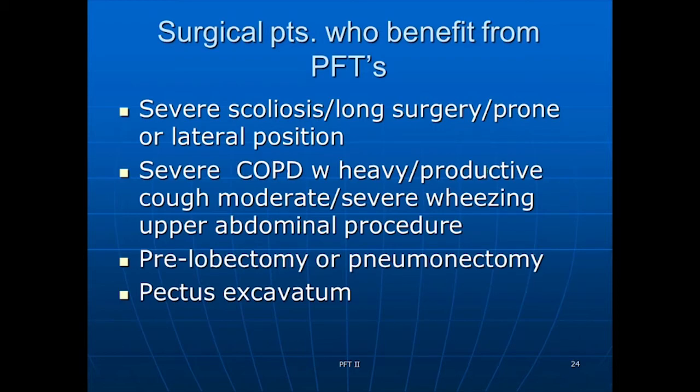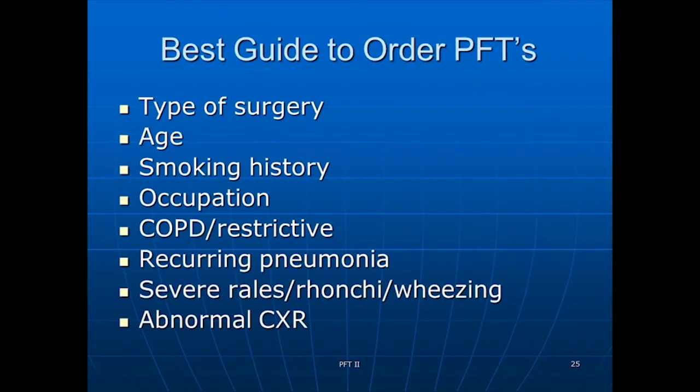Obviously, these patients are going to benefit from having pulmonary function studies. But really, the take-home is anybody who has severe pulmonary disease, and anybody who's going to have any kind of large upper abdominal surgery or thoracic surgery. Those are the patients that are really going to benefit from having pulmonary function studies done.